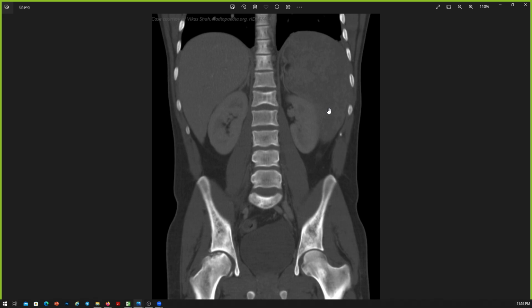So you can be given an abdominal X-ray, but you also can be given a chest radiograph of sickle cell anemia, where you can be shown snow-capped humeri or avascular necrosis of the humeral heads along with absent spleen on the left side, and H-shaped vertebra in the thoracic spine. So these are the findings which can be shown. You can also be shown some patchy opacities in the lungs. That is also seen in sickle cell anemia. So maybe I'll show you a chest radiograph in the coming sessions.